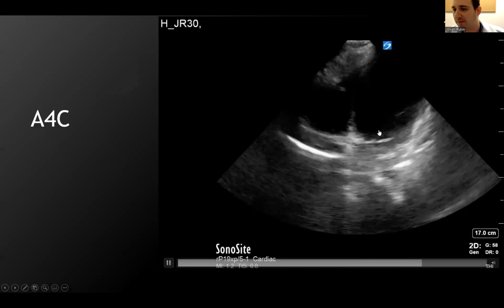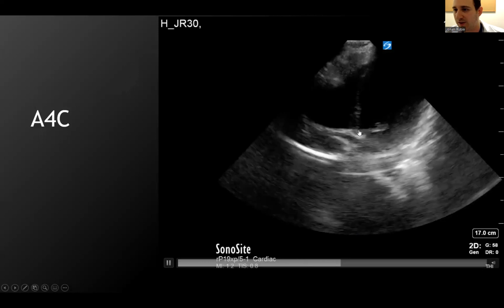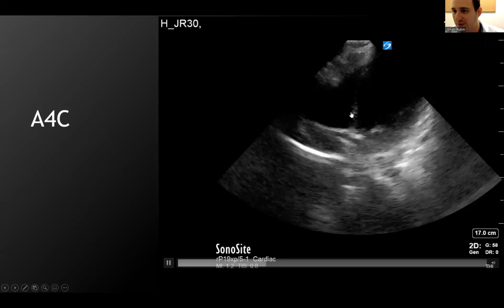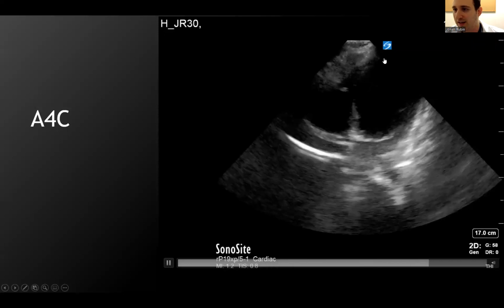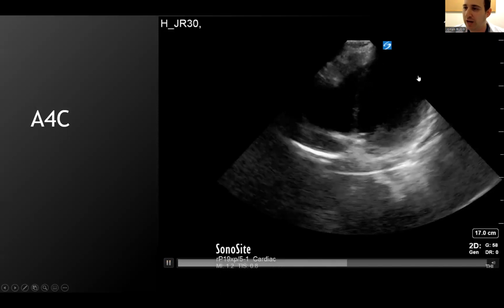And again, I think maybe this is what we might have been seeing at the base, right? We saw this in the parasternal long, we saw this maybe at the mitral valve level and parasternal short, where there's some squeezing activity at the top here. And then just out here, it's almost rounding out. Again, I don't want to say anything because of this poor shadowing and windowing.